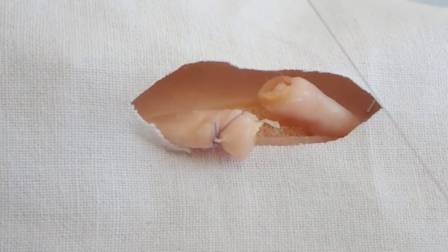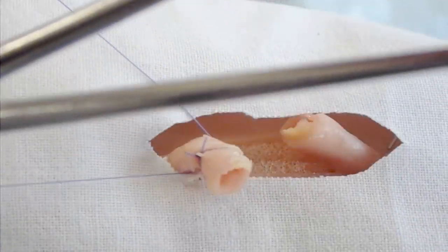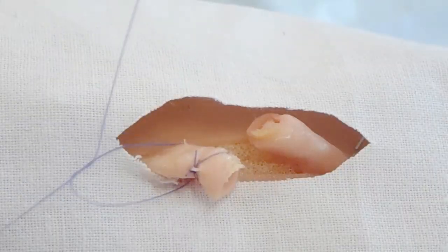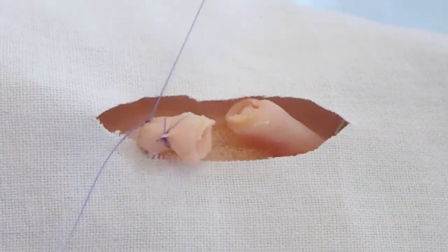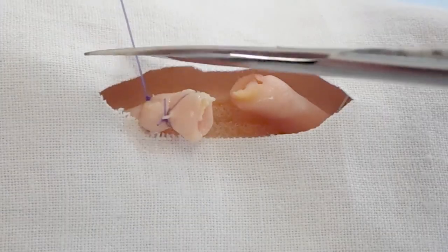A simple ligation is also performed on the central end, approximately 1 cm from the first one. The ends of the filaments are then cut.